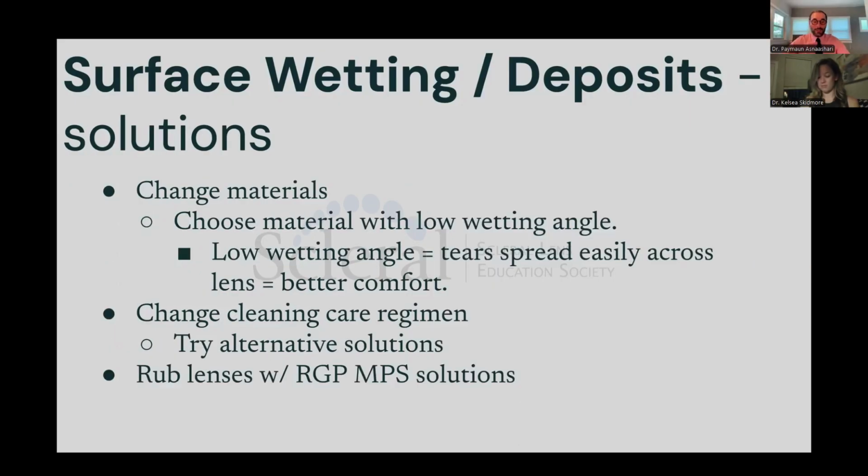And here are some solutions for it. You want to consider changing the lens material to a low wetting angle. With low wetting angles, the tears will spread easily across the lens and provide better comfort. So hopefully it just has less deposits form.